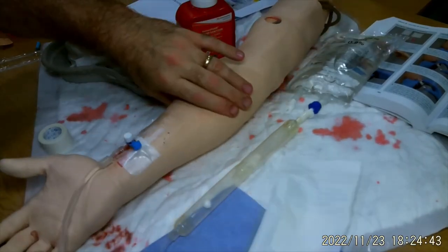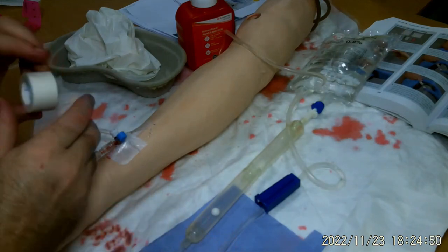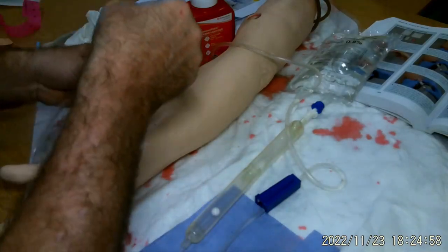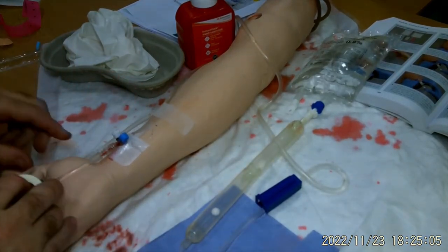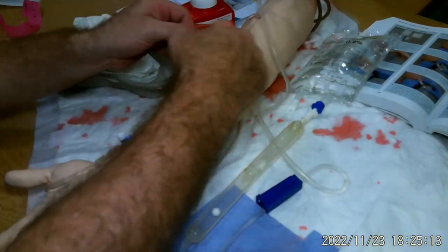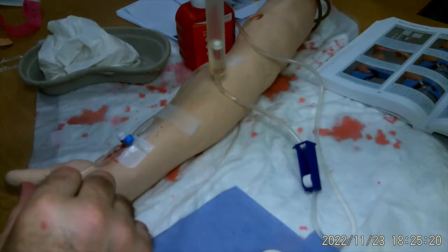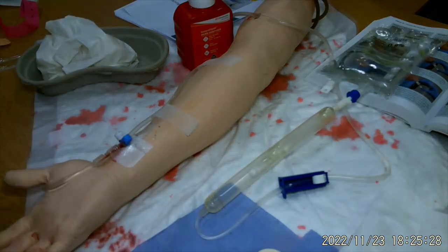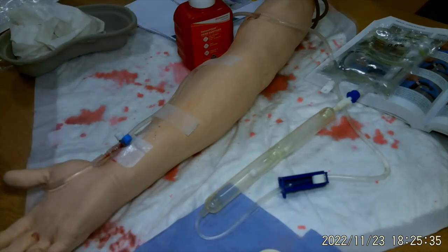I'm now going to secure the giving set in place — just put it around the thumb and up the arm, and use a short length of tape to hold it lightly in place. I might want to put another piece down here just to hold it, and maybe one more up the arm so it doesn't move. Ideally the fluids would be held up on a stand and we can then set the drip rate. But on this mannequin I'm not going to release the wheel — so that would now be the end of my OSCE. I would then tidy up any waste into the right bins.